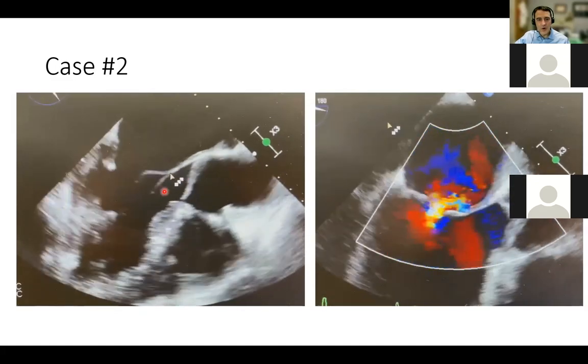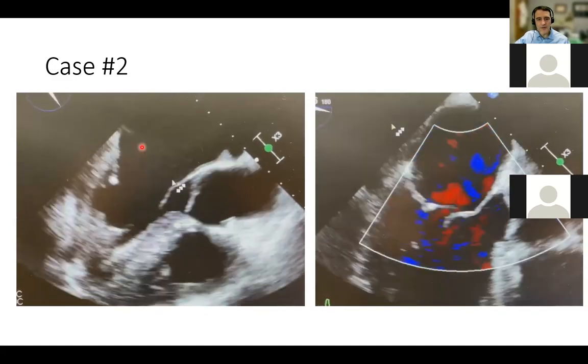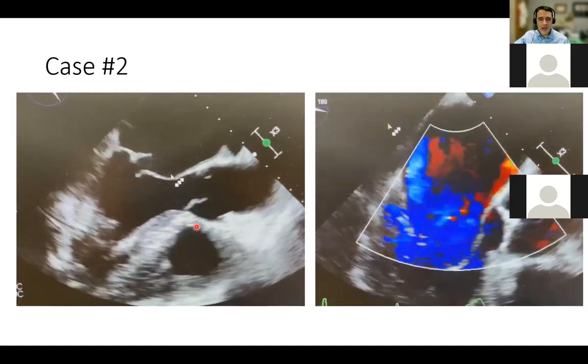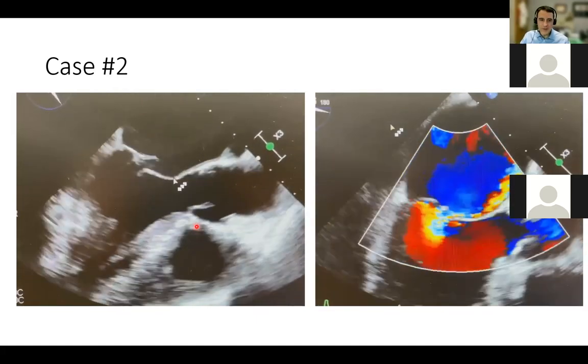While this would normally be, from a surgical point of view, the type of patient we would want to repair, the surgical risk here was felt to be high enough to consider MitraClip.